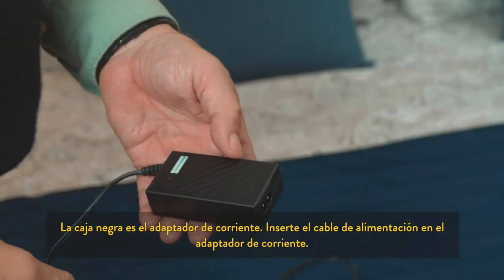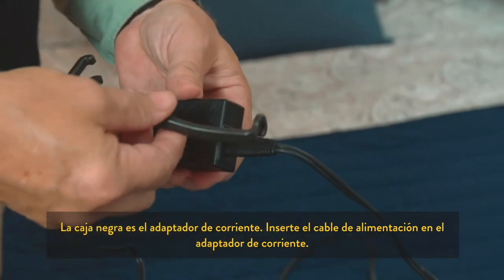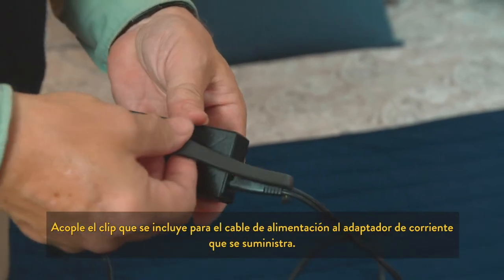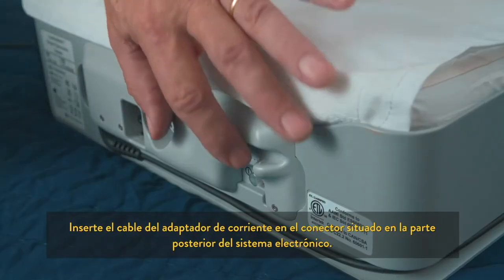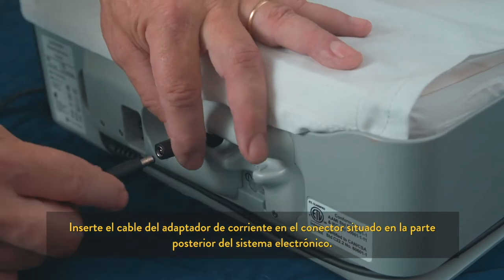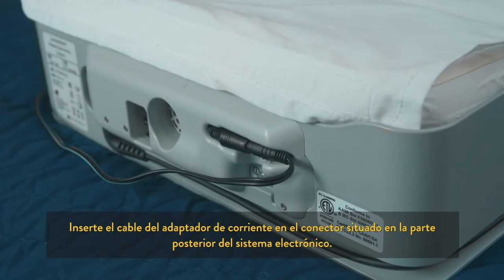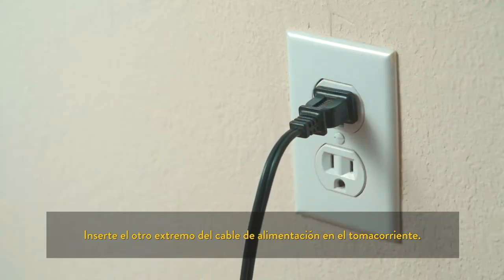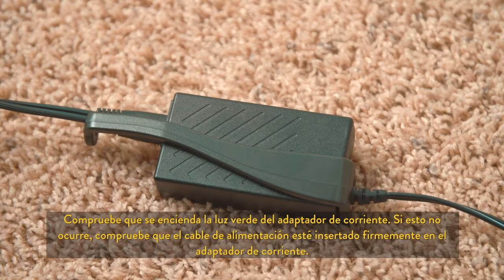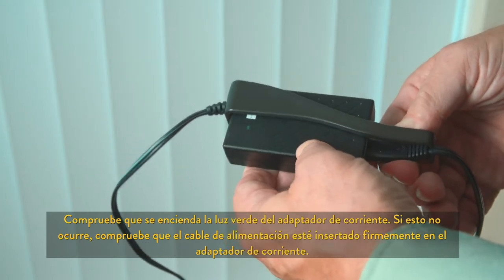The black box is the power adapter. Insert the power cable into the power adapter. Attach the included power cord clip onto the power adapter. Insert the power adapter cable into the connector on the back of the electronics system. Plug the other end of the power cable into the wall electrical outlet. Confirm that the green light on the power adapter illuminates. If not, make sure the power cable is securely inserted into the power adapter.